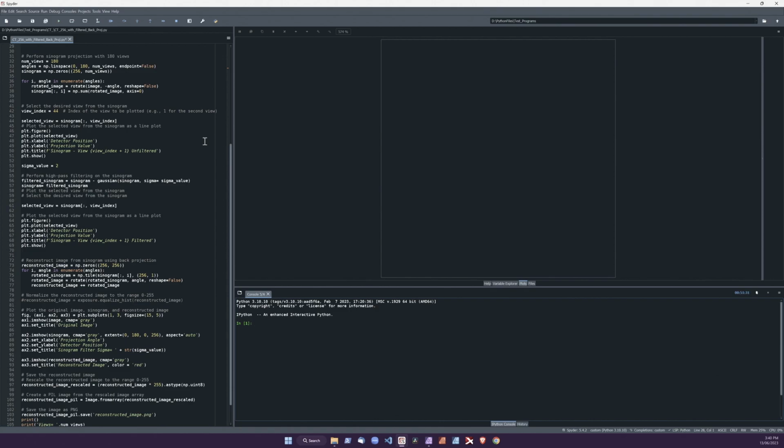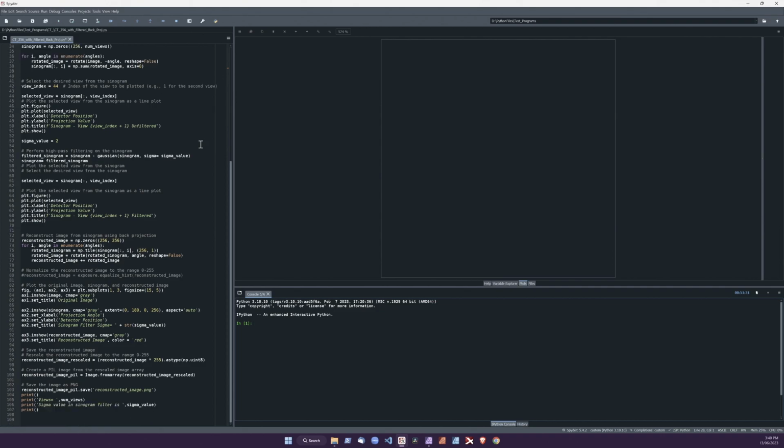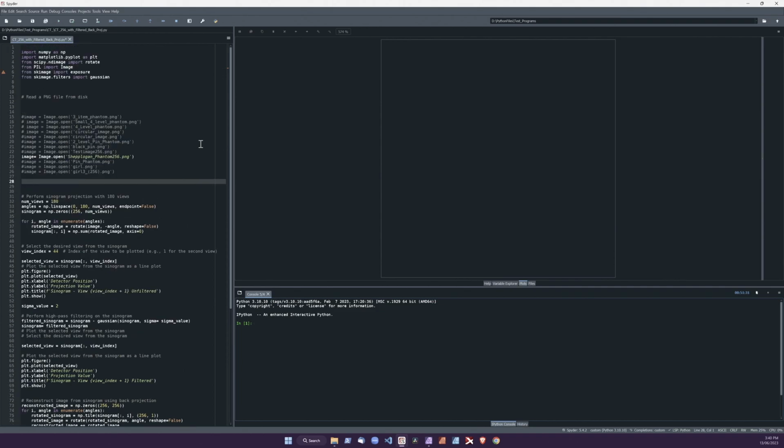So after about an hour and a half between ChatGPT and myself, we iterated backwards and forwards, and I learned to ask better questions and better explain myself to the program so that it could write the final program. This is what we ended up with. I have modified it only very, very slightly. One of the things that I have done is I've made a couple of images in a photo editor, a drawing program, that I can demonstrate the CT function on.